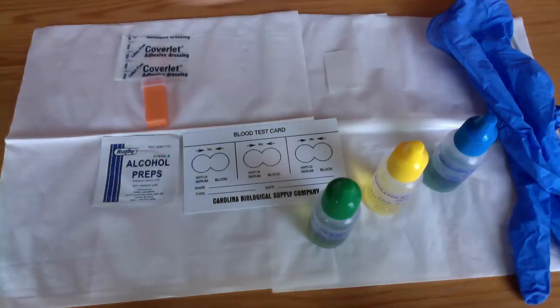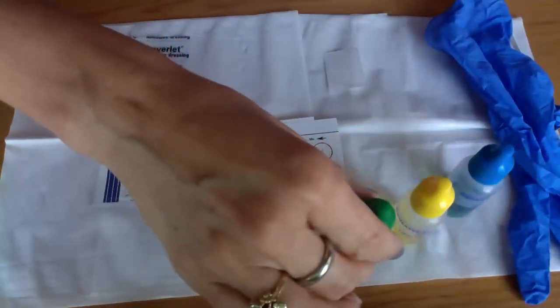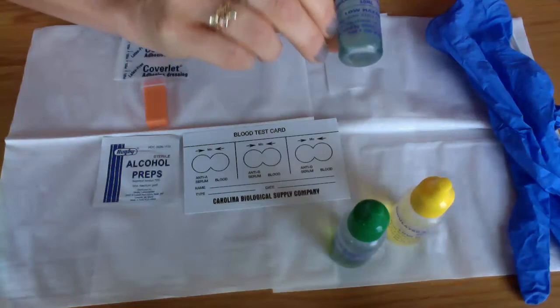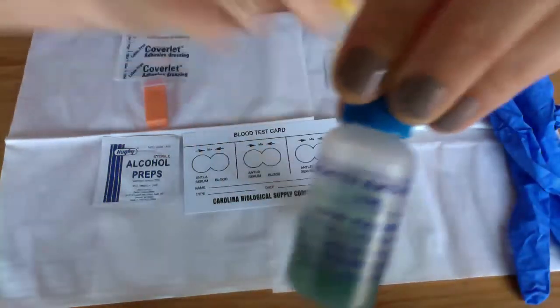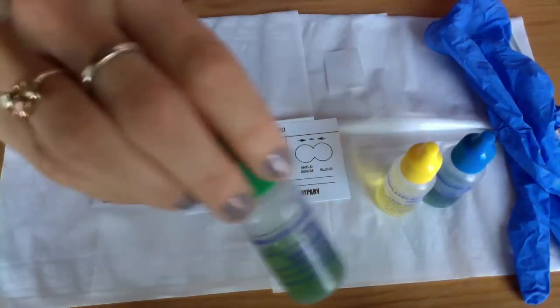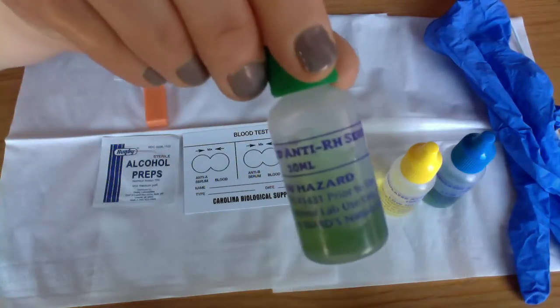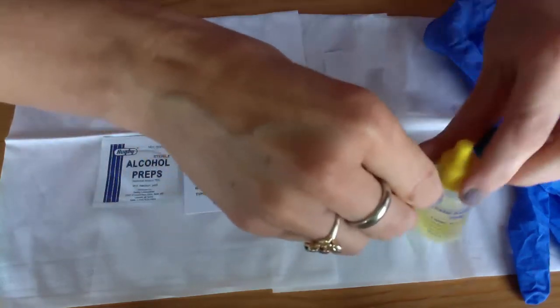I set out my three anti-serums. I've got the anti-A serum here, the anti-B serum here, and you'll see the anti-Rh, or sometimes it'll say the anti-D serum. I've got all of that.